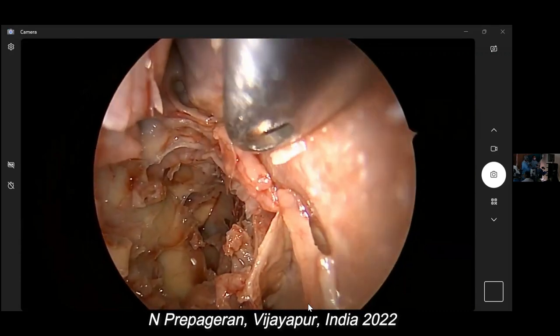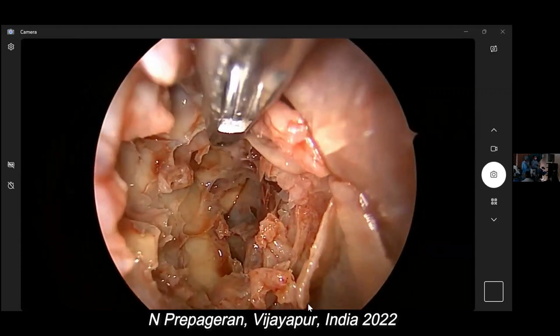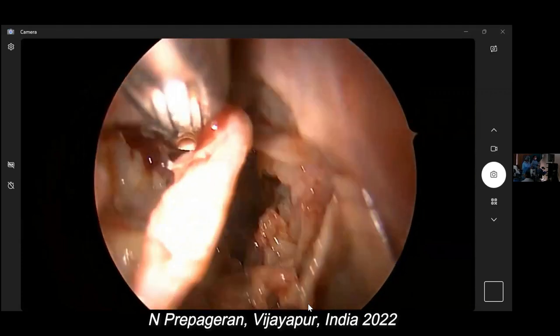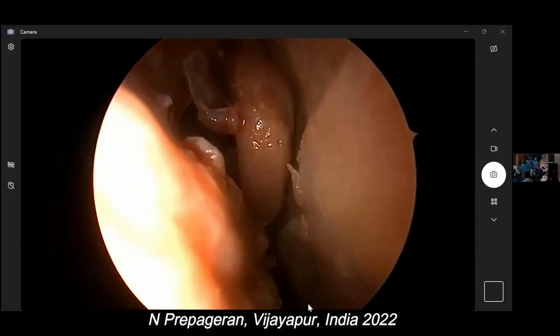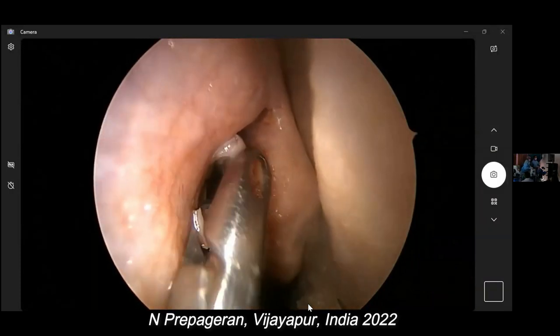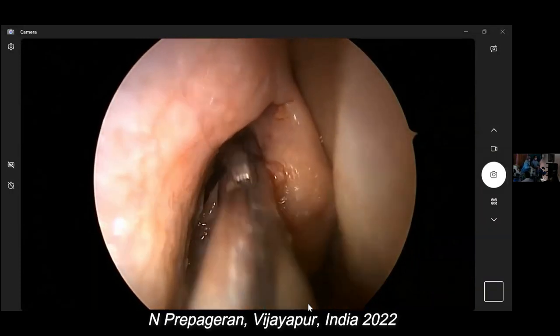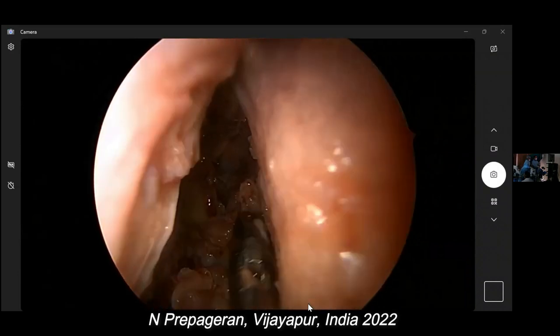And that will take us to the frontal. That's the frontal. So most of the time I do my frontal with a 0-degree scope on the floor. Why? Because I'm a lazy surgeon, as I told you. And you get a good view by just putting it on the floor. I'm just going to remove mucosa because of the cadaveric dissection, okay?